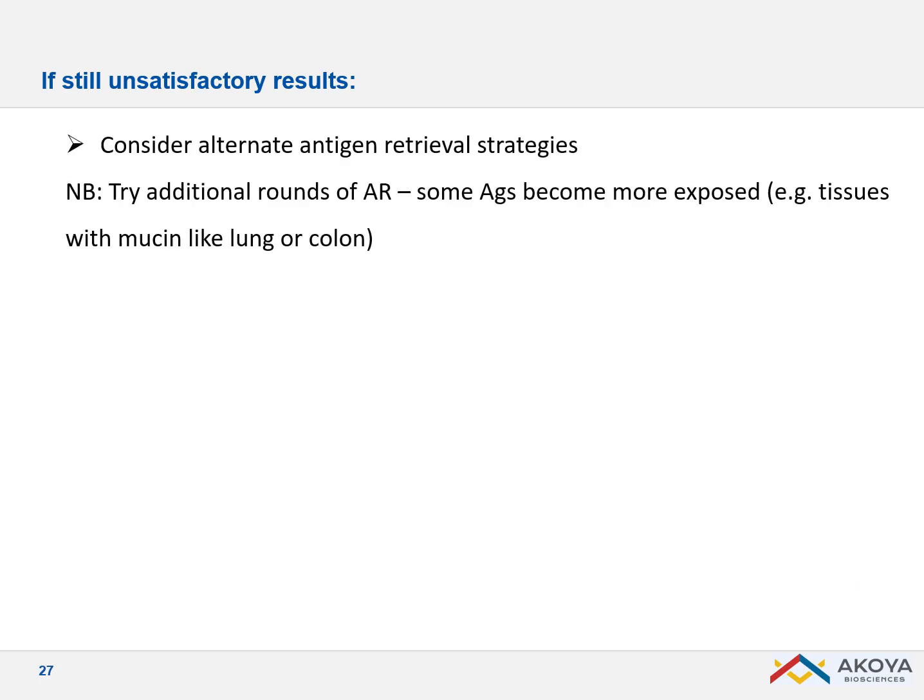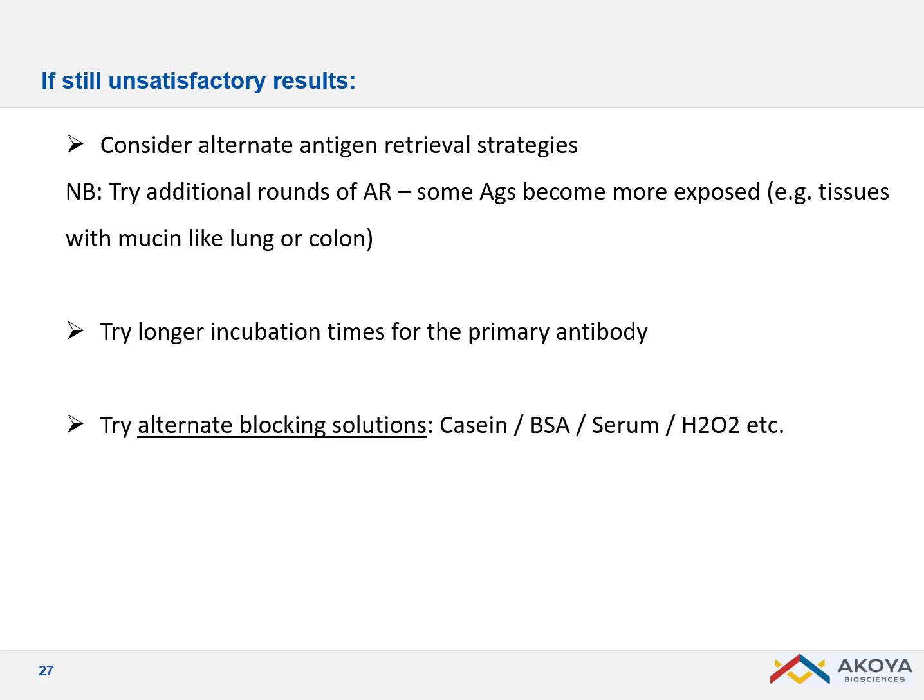If you're still unsatisfied after titration, try different antigen retrieval methods or a longer primary incubation time. I recommend starting with 30 minutes, but you can go up to an hour — overnight incubation tends to bring more background and is often unnecessary. In terms of blocking, feel free to use other blocking solutions to reduce background. And if needed, try another primary antibody clone — today there are many providers and clones available.